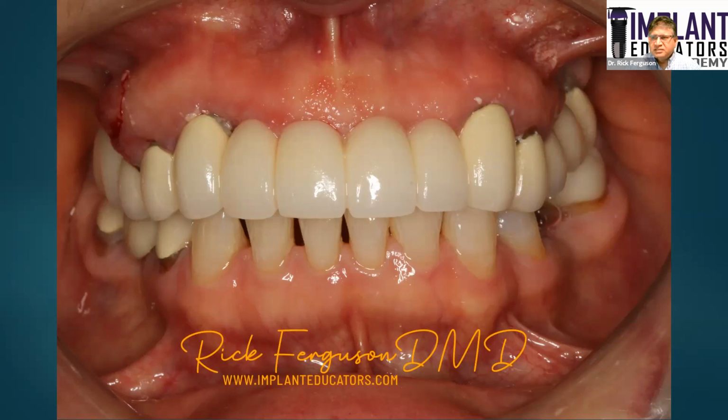So I got the data sets last week, Monday, and we did 3 other cases. So on Monday, I planned all of these cases out between Monday and Tuesday, printed everything on Wednesday, and then Thursday we traveled to the course, and Friday we actually executed all 4 cases. But this was the most complex out of the 4. The rest were just simple 2 supported guides. But this is where the patient started.